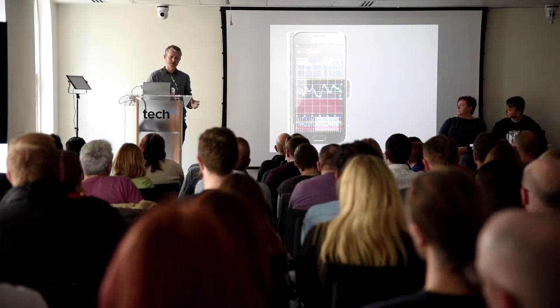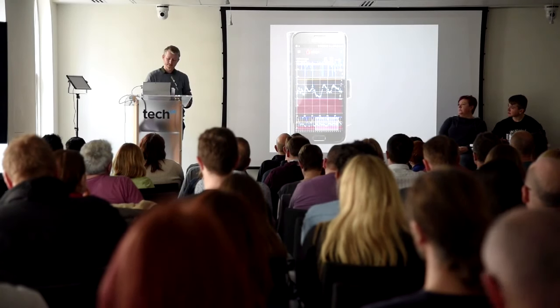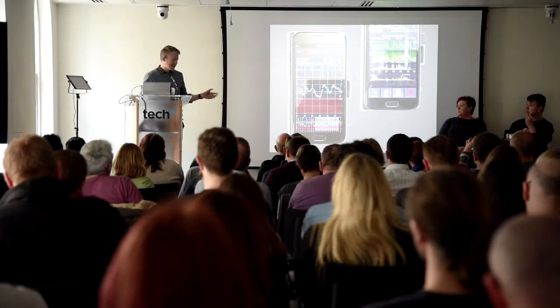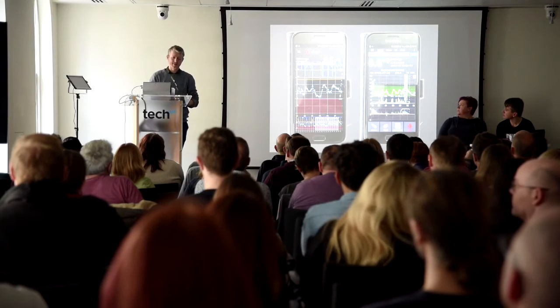I think Dexcom technology is amazing and brilliant. xDrip is much better than the Dexcom app. As well as that, you need the Android APS app itself. That's the brain of the system. That's where the algorithm lives.